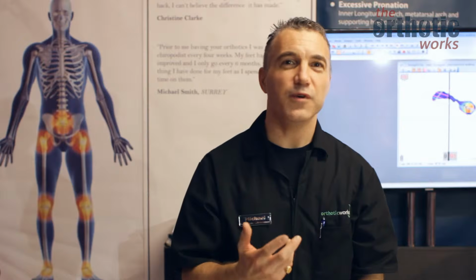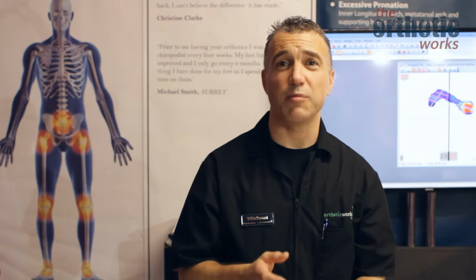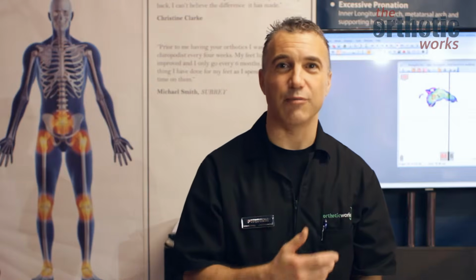What are custom foot orthotics? Foot inserts are supports that help alleviate all types of common foot problems and abnormalities. Functional orthotics are used to help control conditions like plantar fasciitis, policeman's heel, spurs, fallen arches. We use, most commonly, functional orthotics for most of our clients.